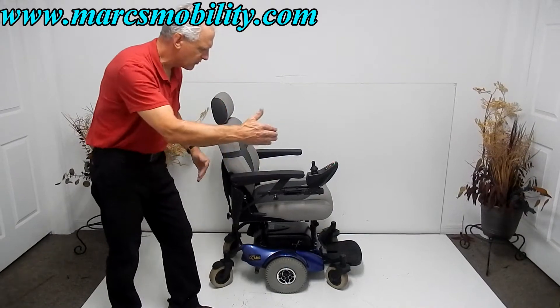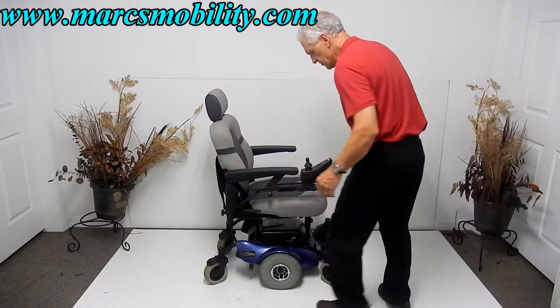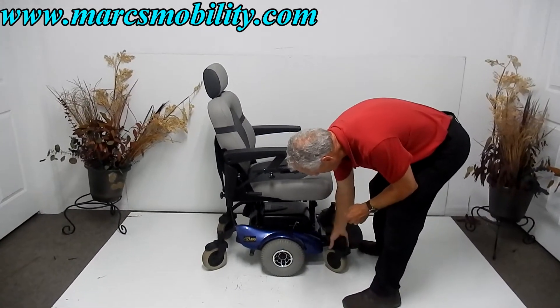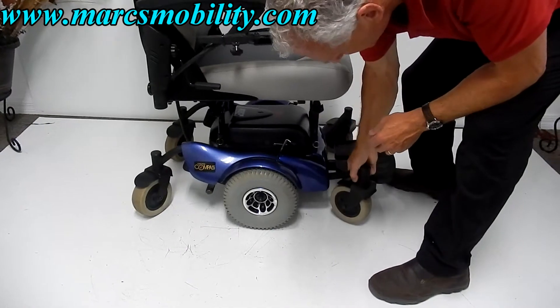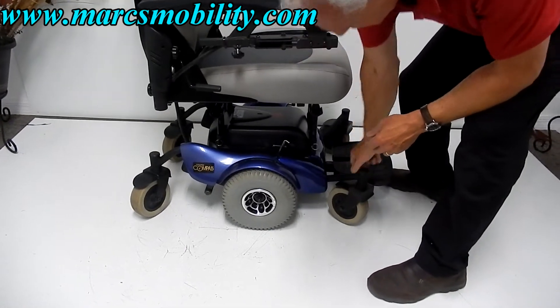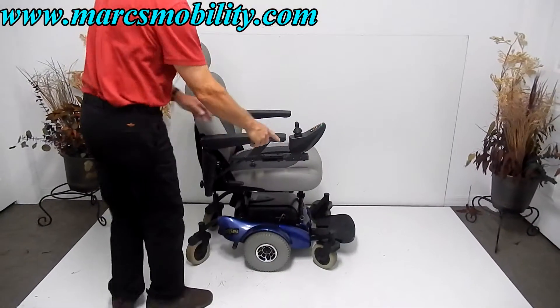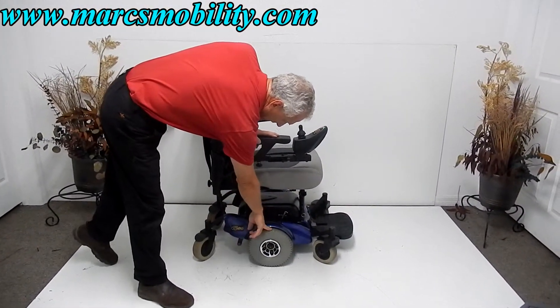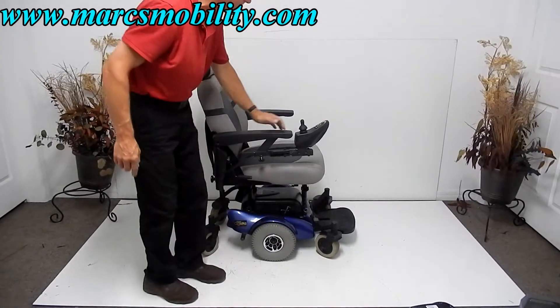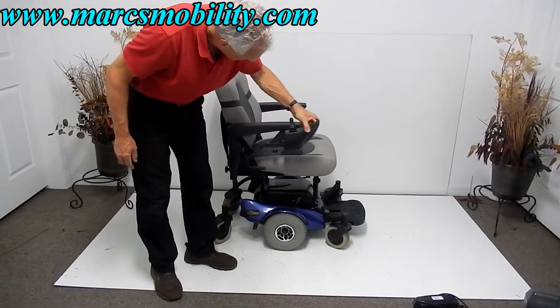The turning radius on the Golden Compass is really small — about 18 to 19 inches. The suspension is fantastic. If I raise the front wheel up you can see the suspension all the way up. That's tied to the motors. It's got great suspension, caster wheels in front, caster wheels in the back, and 10-inch knobby tires.